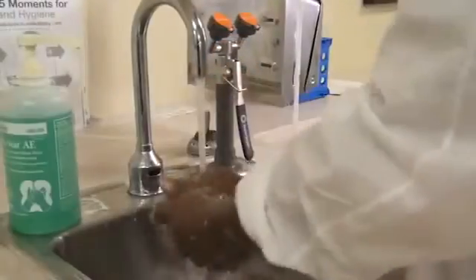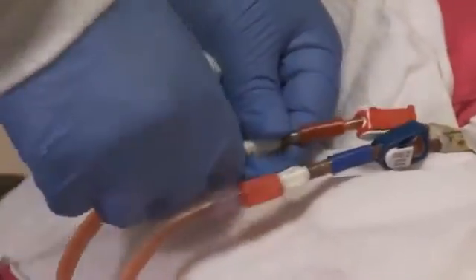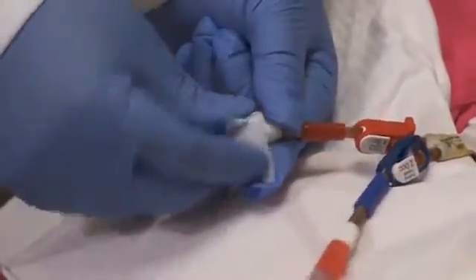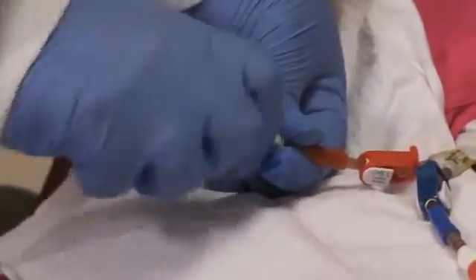While wearing other appropriate PPE, perform hand hygiene and put on a new clean pair of gloves. Make sure to clamp the catheter and then disconnect the catheter from the blood lines using aseptic technique. Once again, apply antiseptic to the ends or hubs of each catheter.